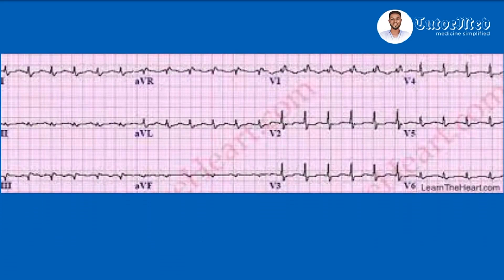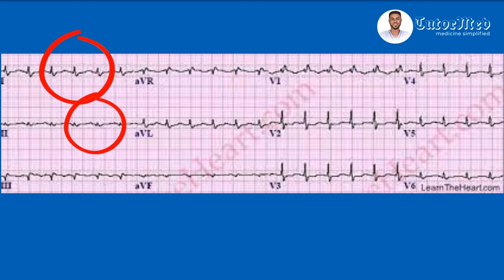Let's look at an ECG with typical low voltage from learntheheart.com. This strip doesn't have a calibration marker, but keep in mind you always need to examine for standardization. We begin by examining the standard limb leads I, II, and III. In lead I, the amplitude of the QRS complexes is less than five millimeters — it doesn't cover an entire big box. The same is true for lead II, which is even more prominent, and for lead III. Using the standard limb lead criteria, this is a low voltage ECG.